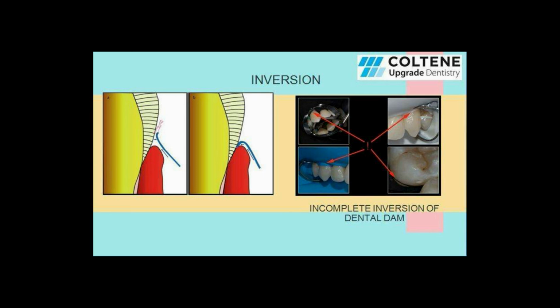So this blue line, or this rubber dam sheet, should always be tucked very neatly and cleanly inside the gingival crevice. This is known as inversion.